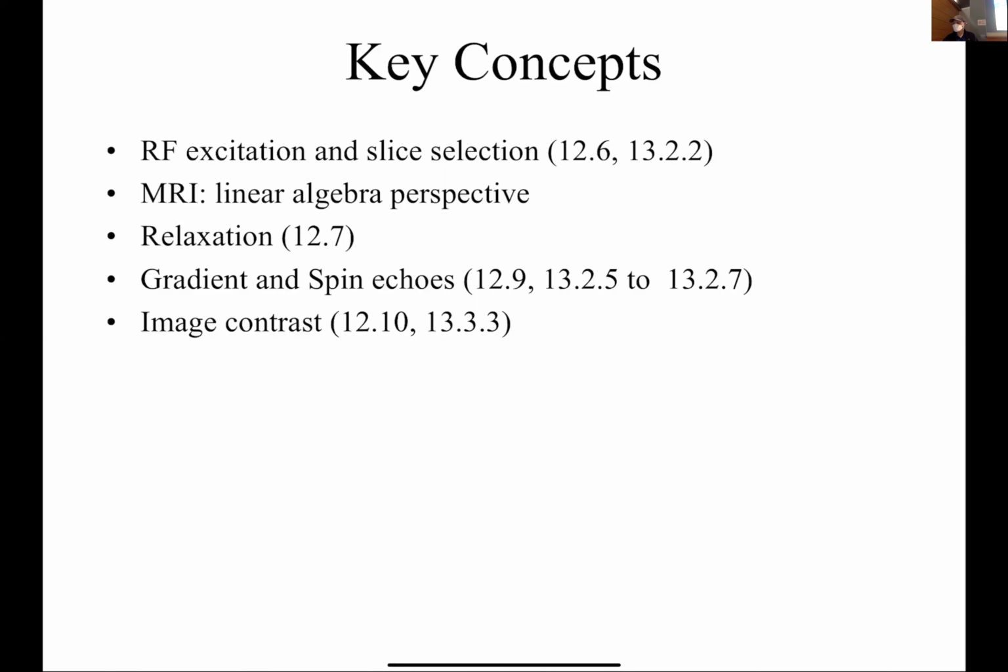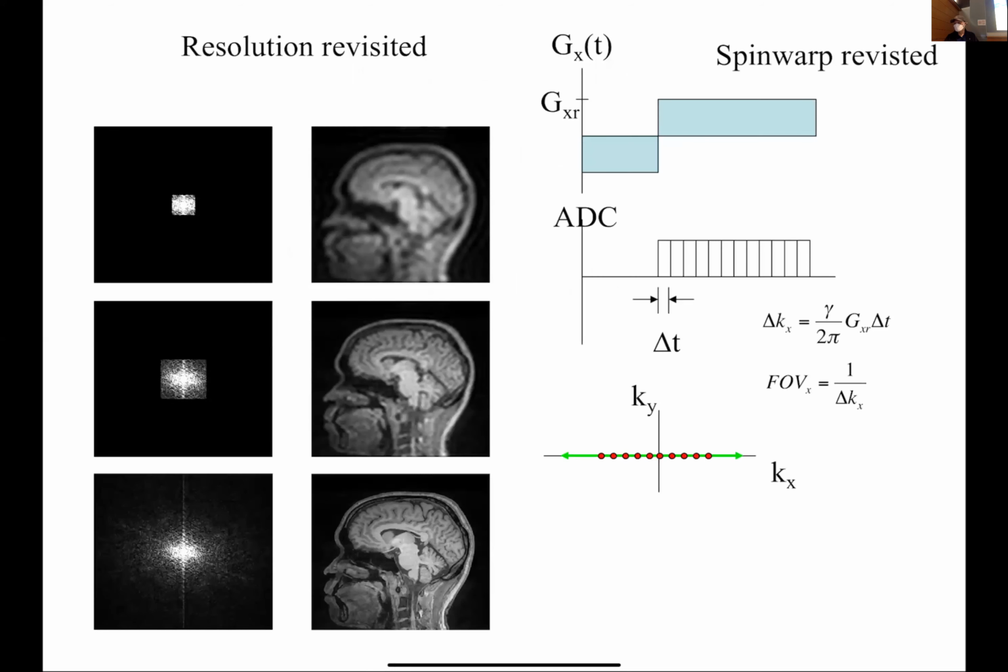All right. Before we start, let me just say a few words about the pre-lecture quizzes. Just to remind you, in resolution, and for this one, I realize that there might be some misunderstanding of what higher or increased resolution means. Increased resolution just means as I'm going from here to here, that's increasing the resolution. But this also means the delta is going down. So that might be where some people got confused. So for those people who picked the opposite and have that interpretation, I'll just add a point for that.